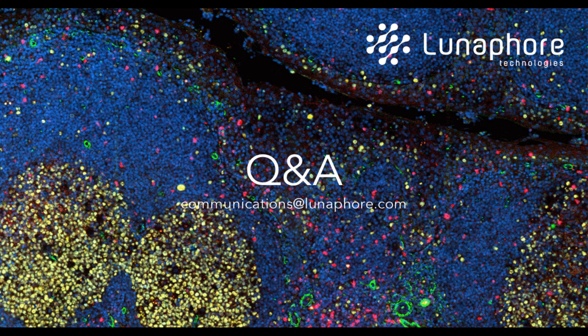What about the maximum sample size that you can evaluate? So the evaluation area is a maximum of 9 by 9 square millimeters. And we are interested in going further in the future, but this is our current area that we can evaluate.